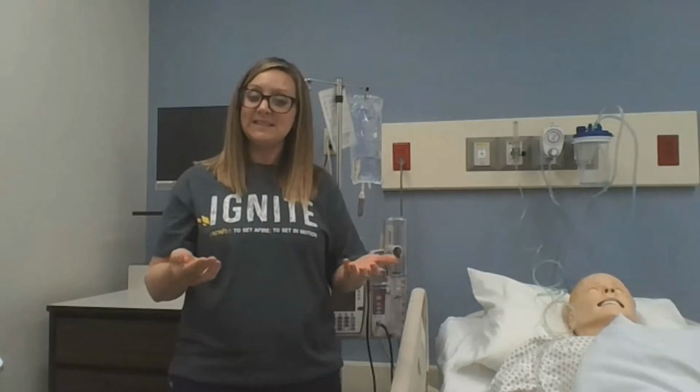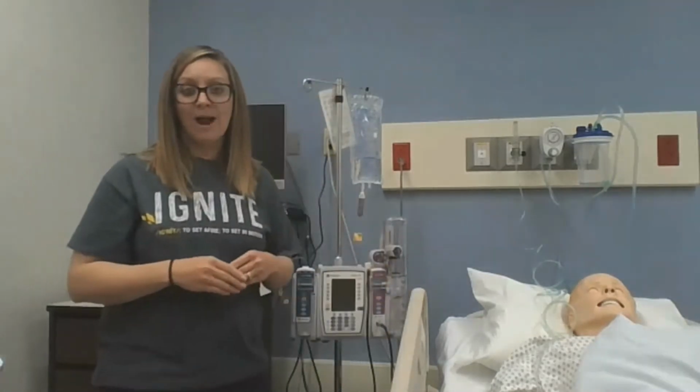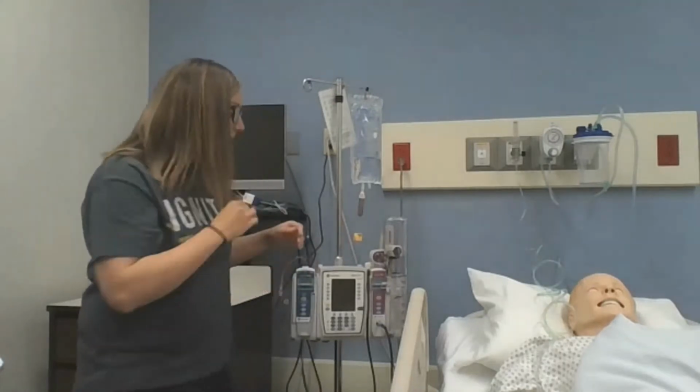You would first want to let the physician know, hey, that's actually against our policy while they're on that PCA pump. And if the physician is insistent, then you would have to go in and make an additional order, definitely documenting your communication, that says, okay, to administer oxycodone in addition to PCA and morphine or something like that. And then, of course, make sure that your leadership team knows that that's happening, because anything that steps outside of our policy, they need to be aware of to make sure that we're doing the right and safe thing for the patient.